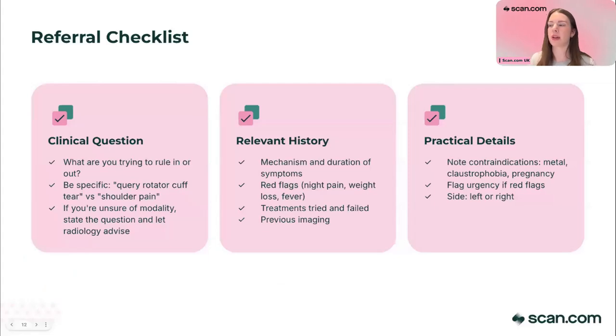Cool. So we have a bit of a checklist here that summarizes what we've talked about just now. The clinical question is really important, being specific about what you think you might be looking for. But also, as you've just said, with regard to views, but also with modality. And I mentioned it at the top of the call as well, we have you guys, thankfully, and our in-house clinical team.